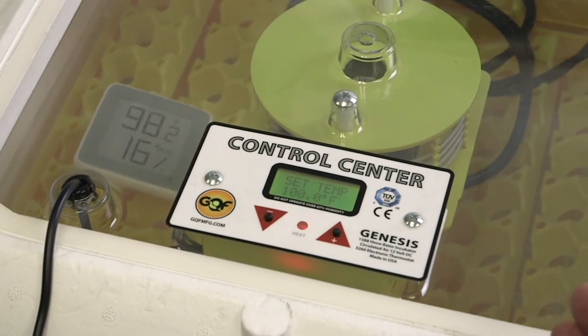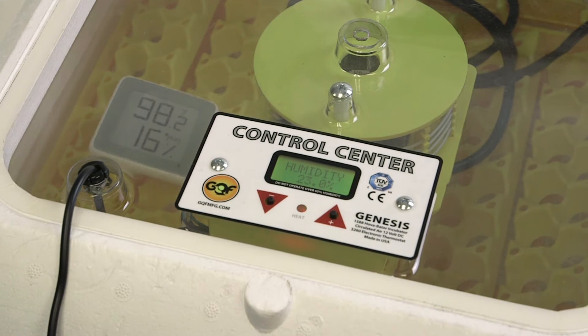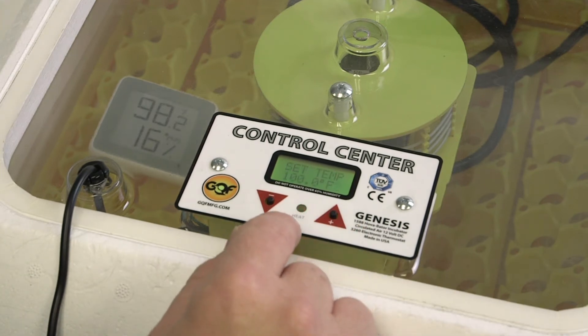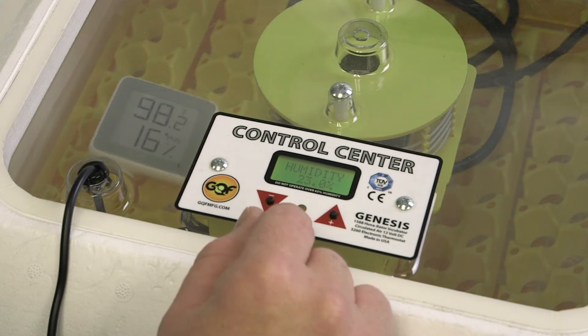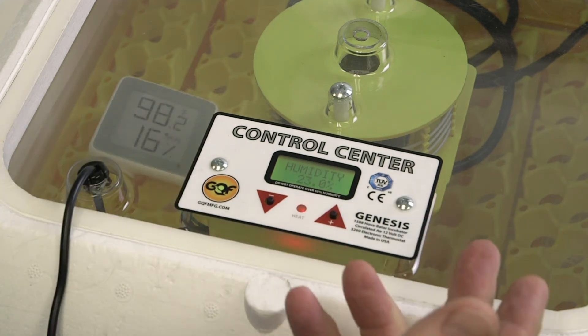The latest version of the Genesis 1588 works very similar to the previous version, except the light is going to blink constantly as it's regulating temperature. Whenever it's cycling, it's going to blink constantly. You also have a day counter.